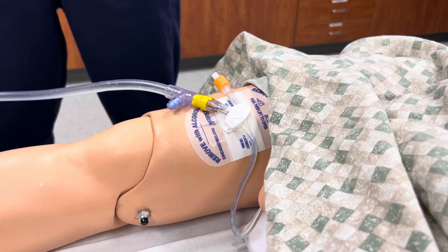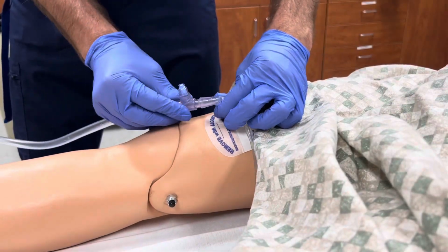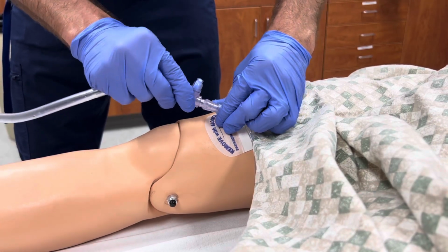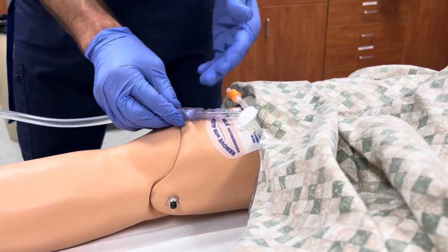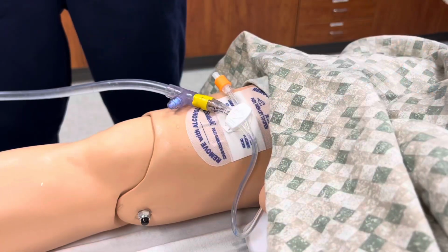Maintain a closed system with a seal between the catheter and drainage bag to prevent risk of bacterial entry into the system. The purpose of the colored seal is to show that this is a closed system that has not been opened. Once a system is opened or is repeatedly opened, the infection risk increases. We should immediately replace an open system unless there's a legitimate reason, such as bladder irrigation.